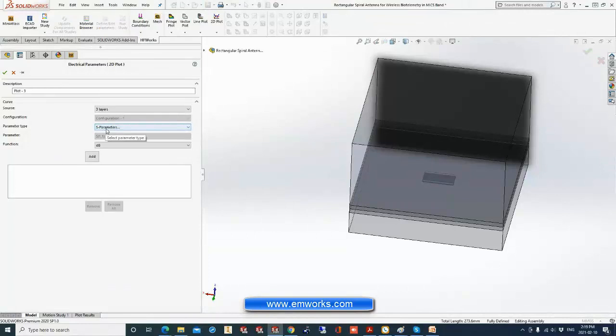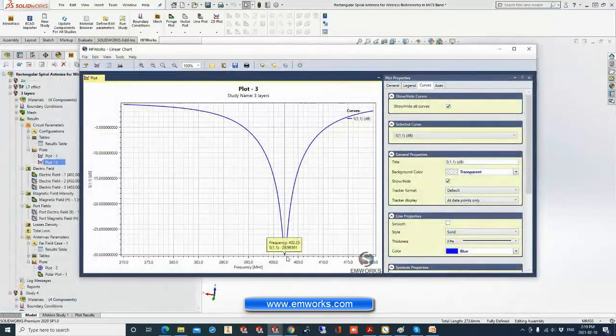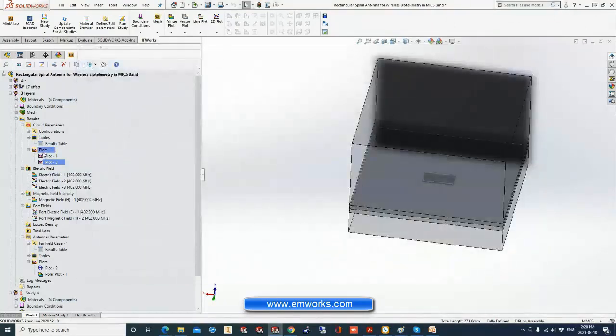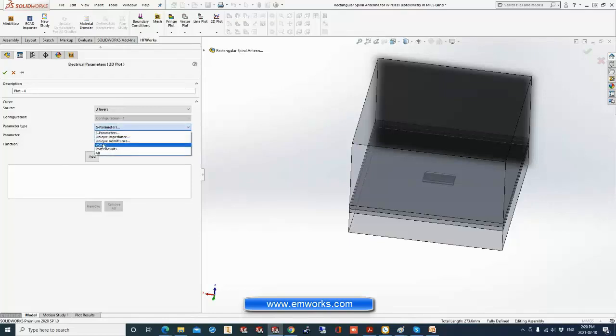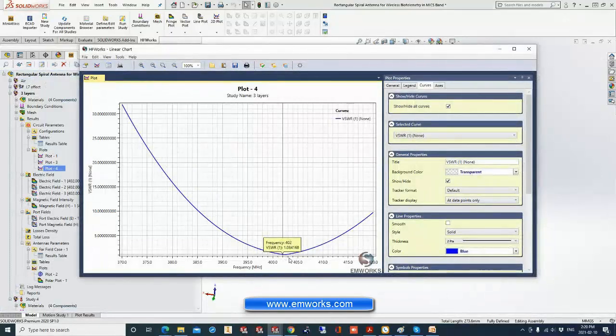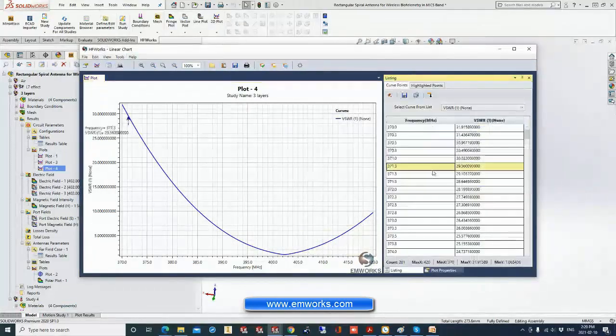For example, you can select the S11 and plot S11 versus frequency. So the resonance frequency is about 402.25 megahertz. At this point, we got almost minus 30 dB. And this is the list of the S parameters. We can also make another plot, of VSWR. So this is VSWR, a minimum of 1.08 at the same frequency, the resonance frequency.